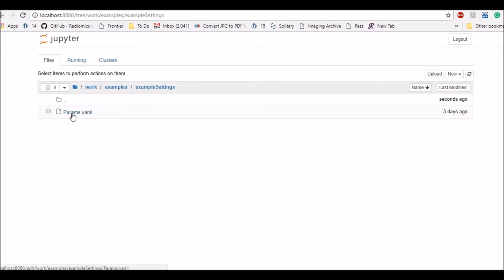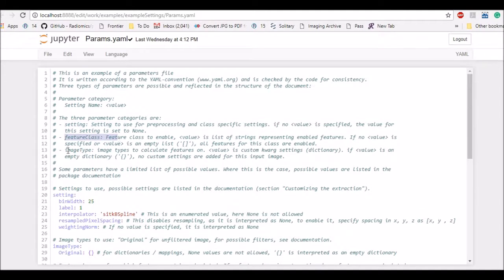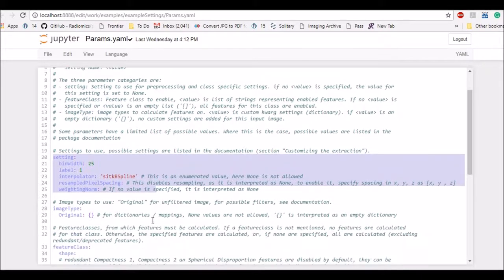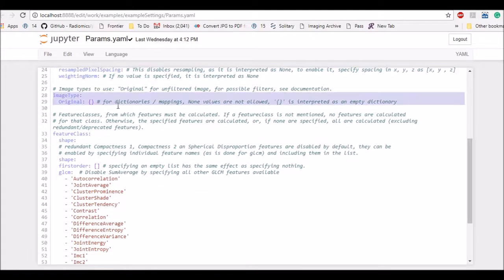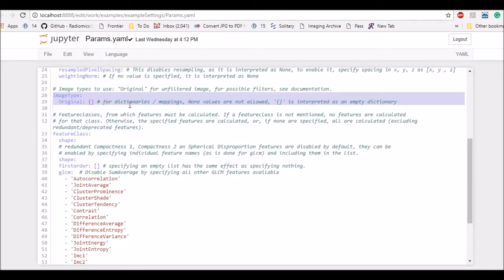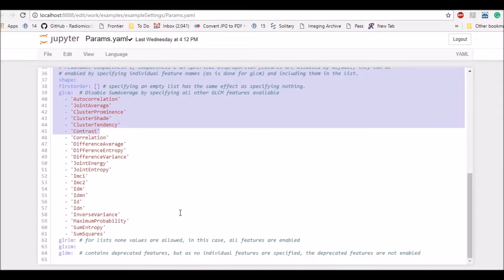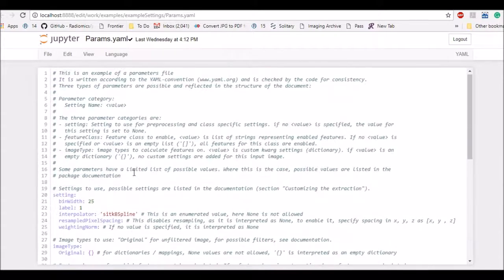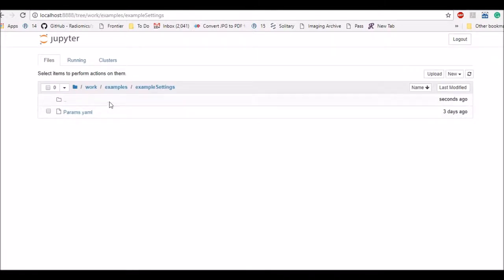You have a parameters yaml file. So in the parameters yaml file there are three main sections: settings, the feature classes and image type. In the settings section is a standard setting section on how the pyradiomics will be run. In the image section you will specify what kind of filters you want to apply for your images. In our examples we are not specifying any kind of filters for enhancing the image or doing any kind of processing so we are using the original images. And then in the feature classes you can specify what features you want to analyze or extract. In our case we are pretty much using all the features: shape, first order, glcm, glrlm, glszm, and gldm. So you can change these parameters for your examples but for our basic examples we'll be going with the regular yaml file which comes with the package.